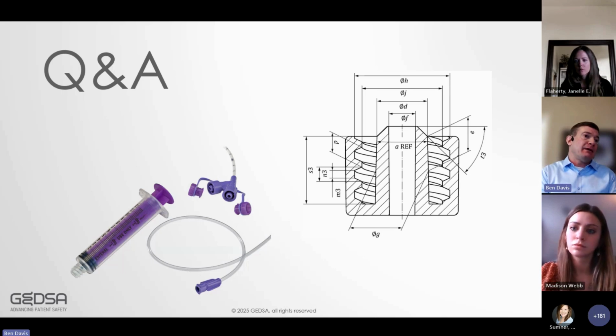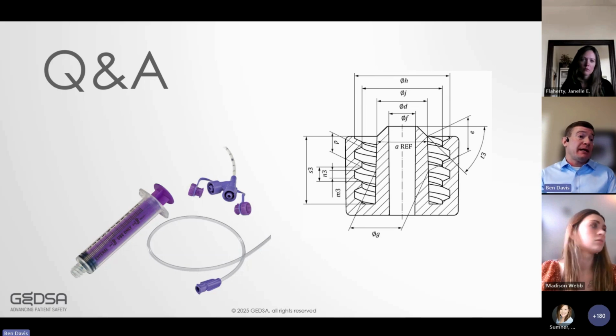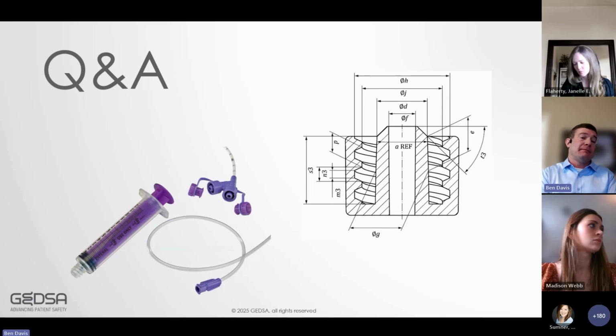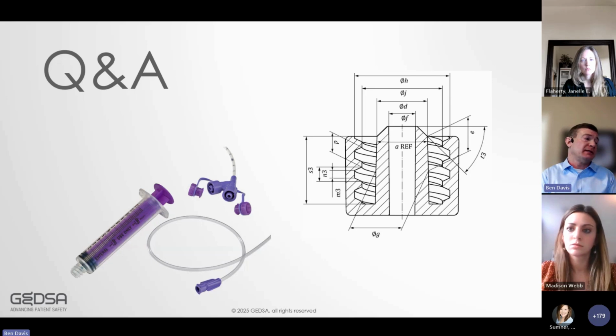In Japan, a company came out with an ENFit compatible solution to make the through bore larger, but then they also had a low profile device where the actual connection point was larger as well, so that they basically removed that bottleneck. So I do believe there are compatible solutions available that need to be explored, and I encourage our manufacturers to pursue those items. With innovation, a lot of times they keep their cards close to the chest, but I'm hoping we do end up with more and more solutions as we move forward.